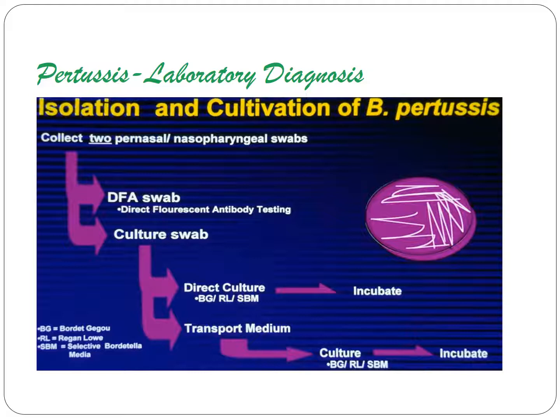Bordetella pertussis is very fastidious, as we have already learned, and the growth requirements to isolate and recover this organism are particularly difficult. The yield of culture can be affected by specimen collection, transportation, and isolation techniques. So specimens from the posterior nasopharynx, as I mentioned just earlier, not the throat, should be obtained using dacron or calcium alginate, not cotton swabs. We already learned that from Micro 1.